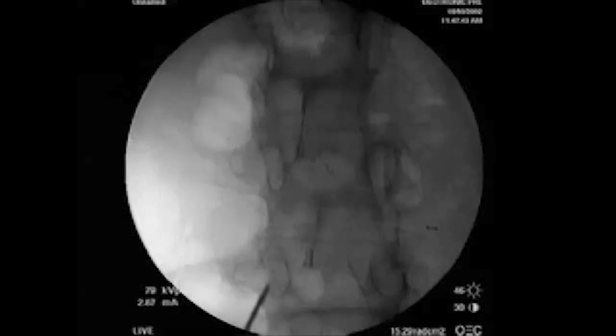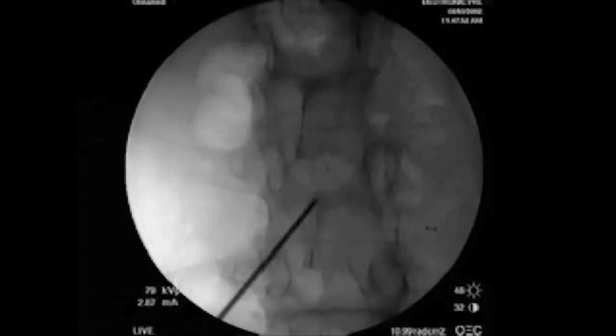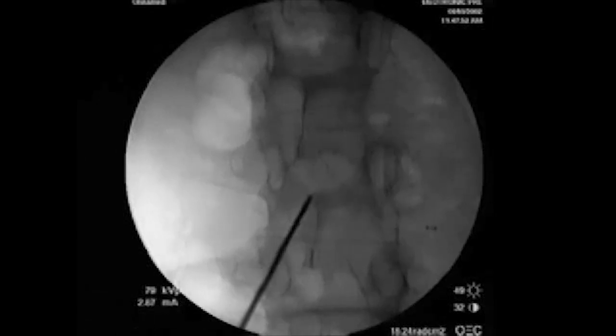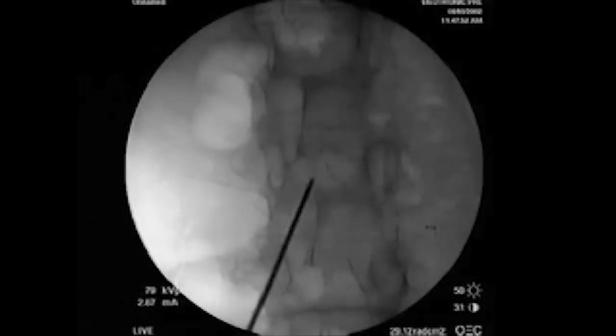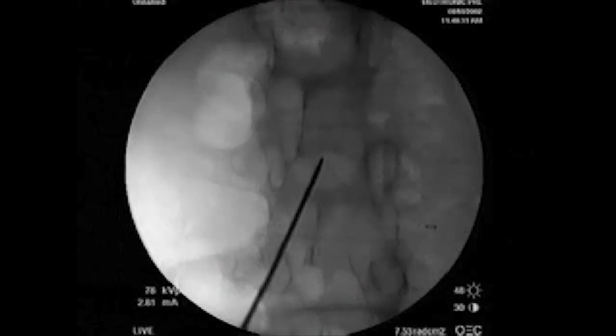The shallow angle oblique approach is essential in preventing complications of the catheter being sheared that occurs with a midline approach. The use of fluoroscopy is essential in positioning the needle. It allows you to place the needle very precisely without having to make multiple punctures. It also allows you to use the shallow angle oblique technique. L4-5 and L5-S1 have the greatest motion, so we preferentially try to place the needle at L2-3. Go from the L3 pedicle up to the base of the next higher level.